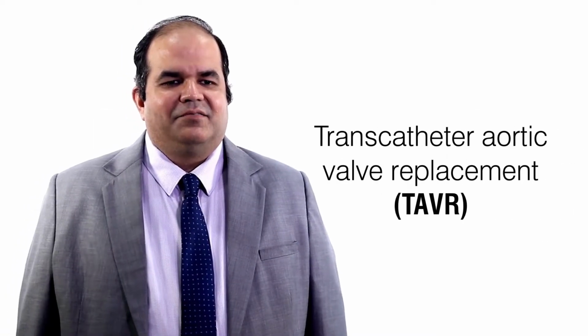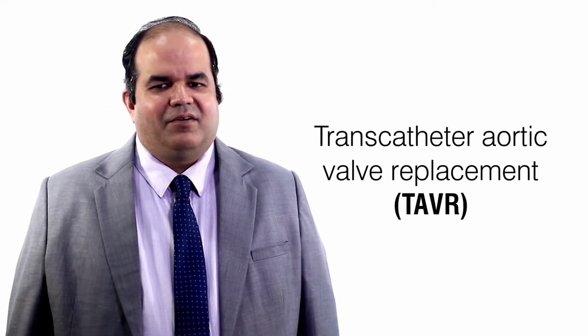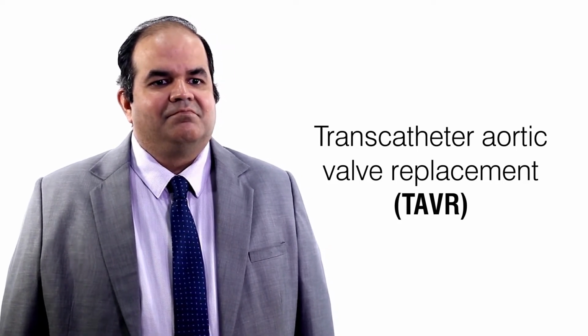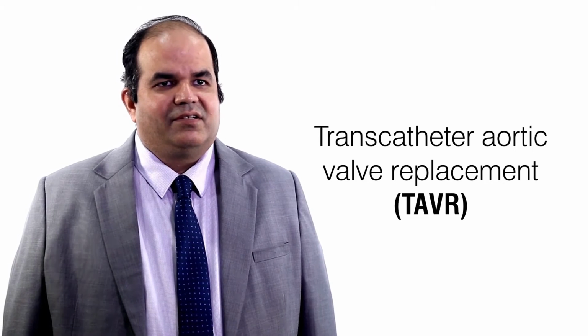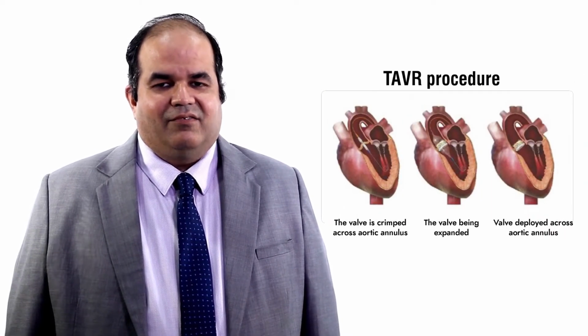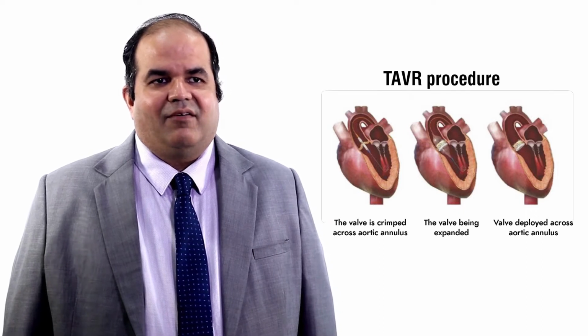So transcatheter aortic valve replacement, or TAVR, is a technique by which you introduce a sheath, a tube-like structure, into a major artery of the body, which is the common femoral artery. From this we pass a wire which goes across the aortic valve, and over this we pass a balloon to crack the valve so that there is space for the new valve to enter.